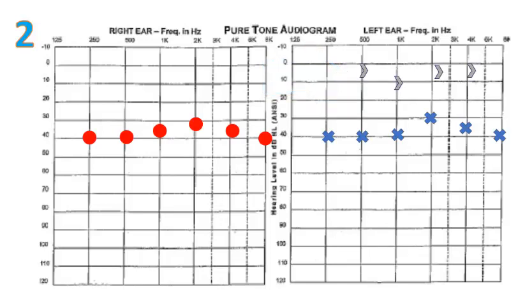In this situation, we know that one of the ears has a conductive hearing loss at each particular frequency, but would need to complete masked bone conduction testing to determine the nature of the hearing loss in each ear. So we don't know which ear has the conductive hearing loss at each frequency. We know that one of them does. We can't really infer any ear-specific conclusions.